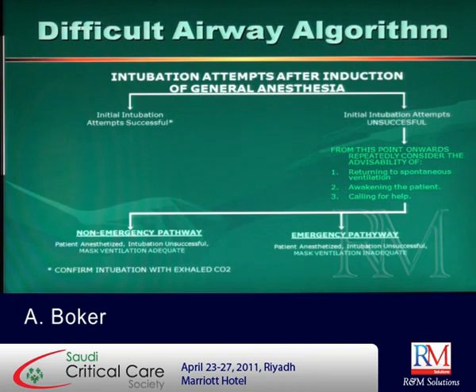Cobra, Glidoscope. What else? What are other options? Cobra tube, CMAC. CMAC, Bougie. What else? Where are the nurses? They're meeting you here. Wake up. I'm saying about intubation now. McCoy. You know McCoy? This is a laryngoscope with moving tip. Okay. What else?